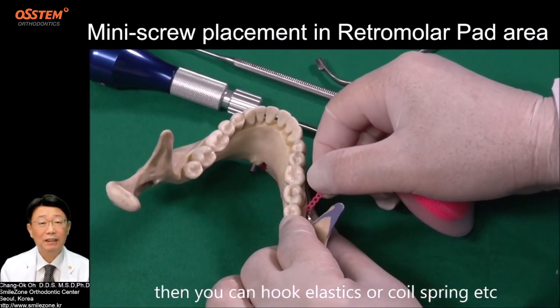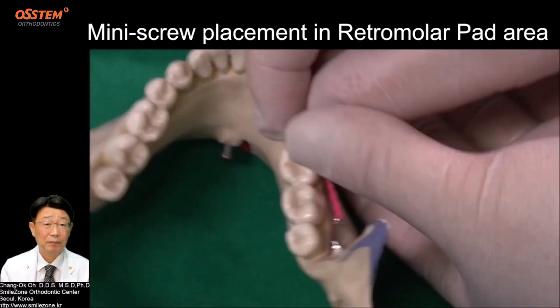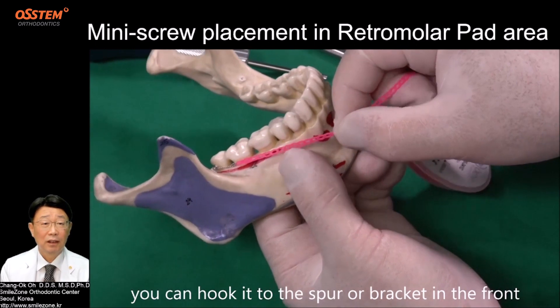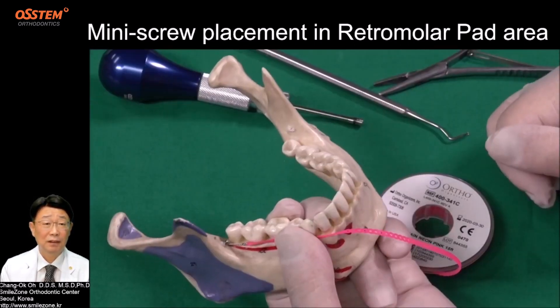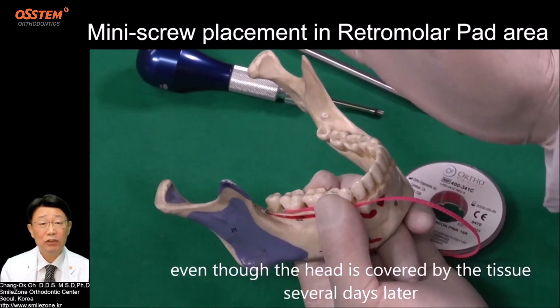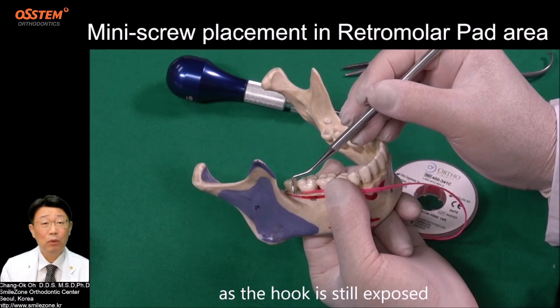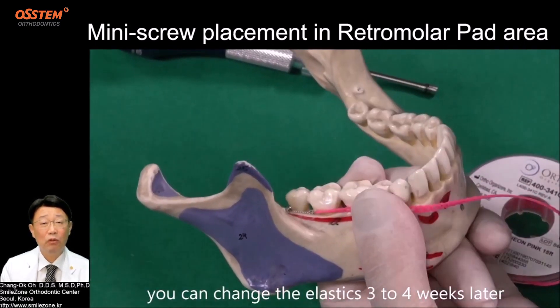You can then hook elastics or a coil spring to the wire extension. Squeeze the hook for retention of the elastics. You can hook it to the spur or bracket in the front. Even though the head is covered by the tissue several days later, as the hook is still exposed, you can change the elastic 3 to 4 weeks later.